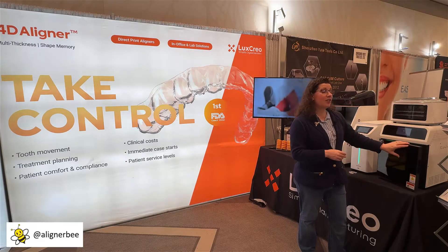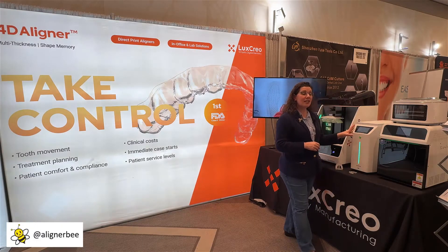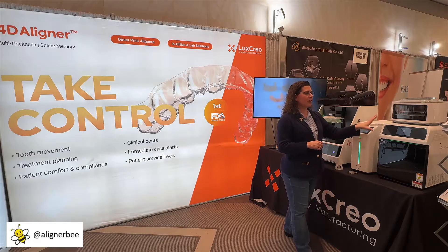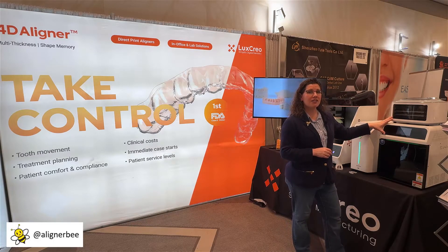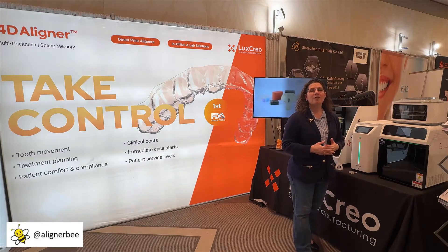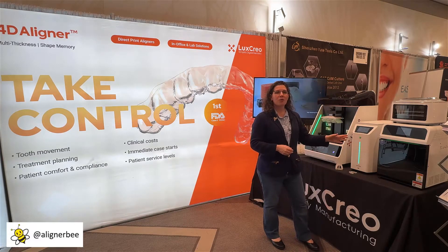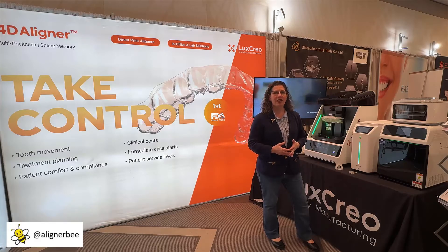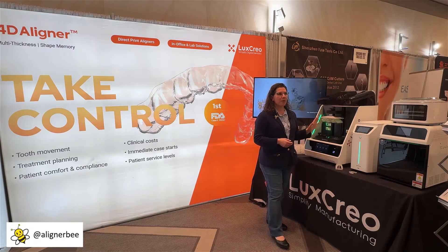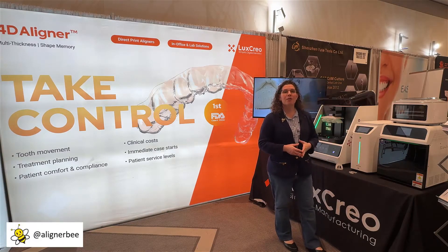The drying and light curing process takes approximately 40 minutes. So as we can see here, with the 13 minutes of our wash cycles and approximately 40 minutes to dry and to cure, we're looking at just shy of an hour of post-processing time. This is something that we could do in between patients or within downtime in the office. Really some interesting developments with the entire system from Lux Creo and iLux, taking the system all the way from printing through post-processing and curing with the three-step post curing process.